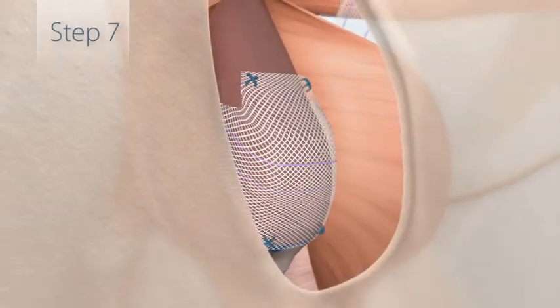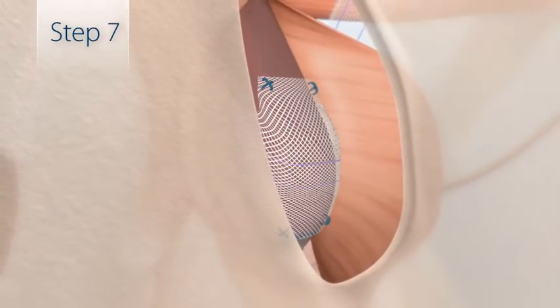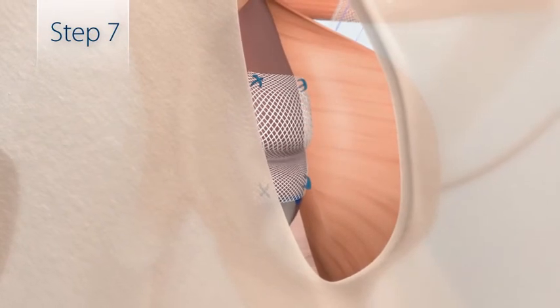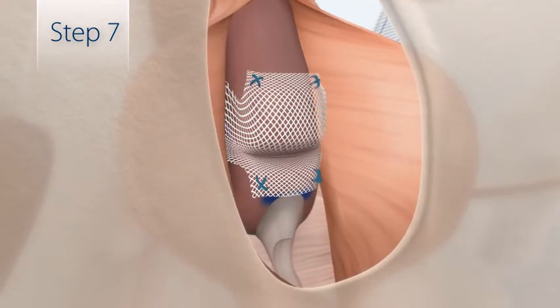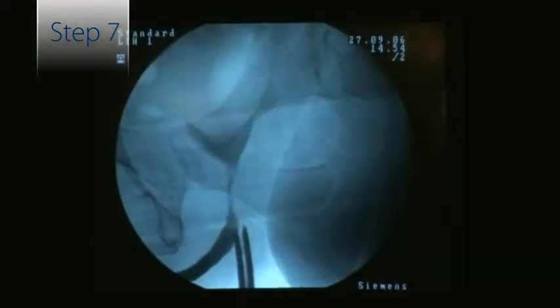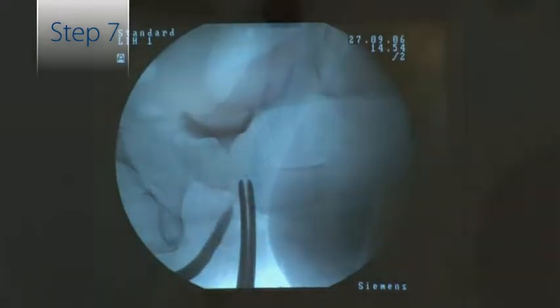The sling is then pulled tight to reposition the urethra. There will be approximately 2 to 4 centimeters proximal movement of the urethra. The motion is parallel to the posterior urethra, repositioning the urethral lumen rather than obstructing it.